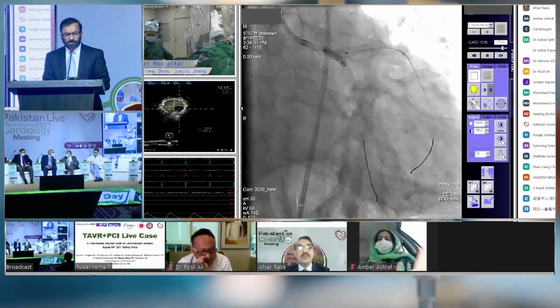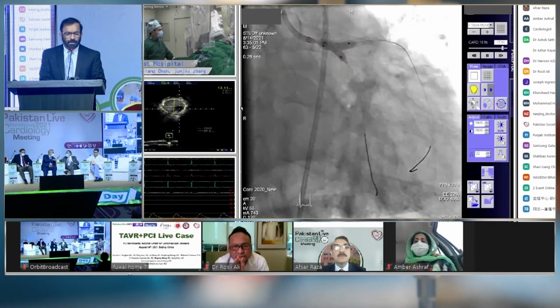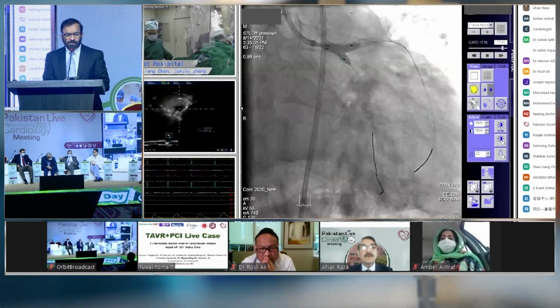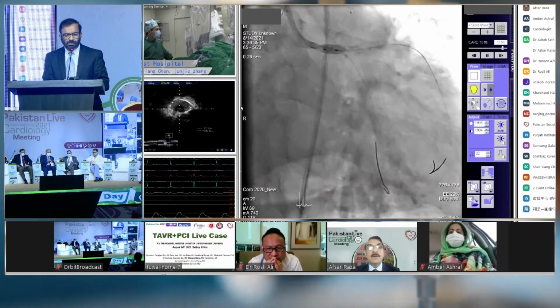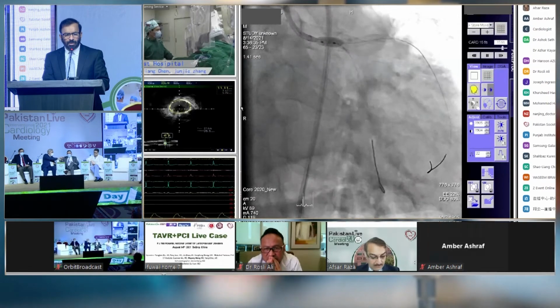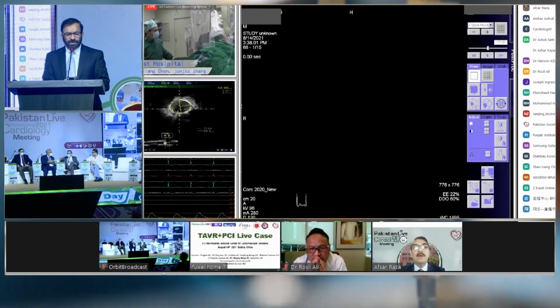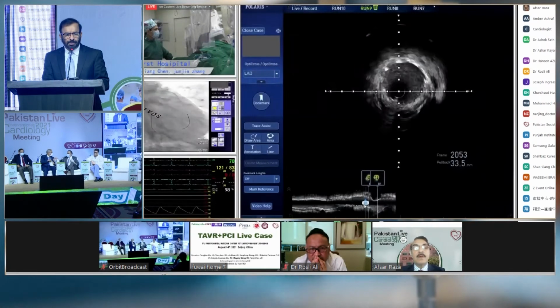So these are two 4.5 balloons? 3.5 balloons. Okay, 3.5. Yeah, this is the final kissing. Okay. We finish with POT. Finally we use the 4.5 balloon to do the POT and complete the case. Okay. Did you do IVUS after all this? Yeah, sure. We do that.